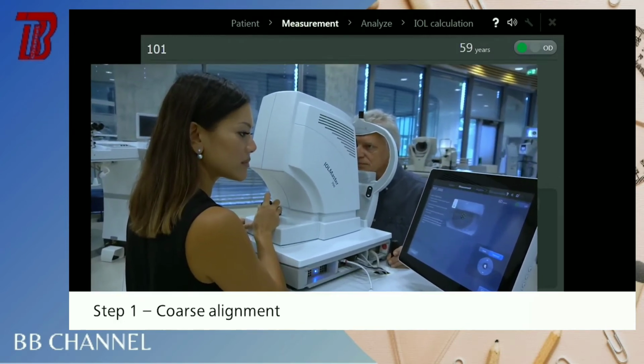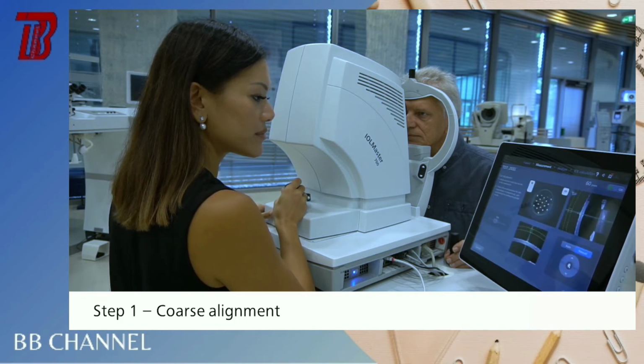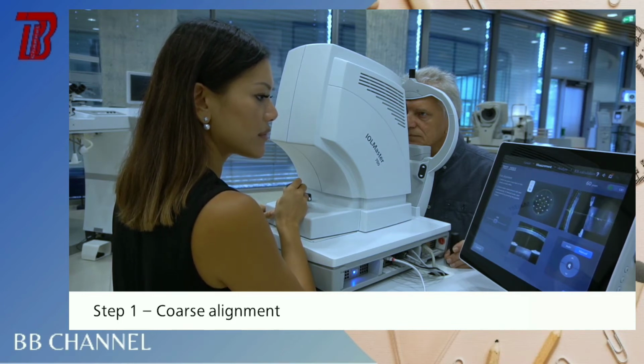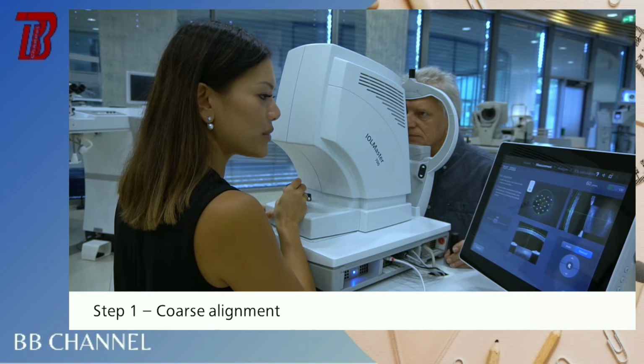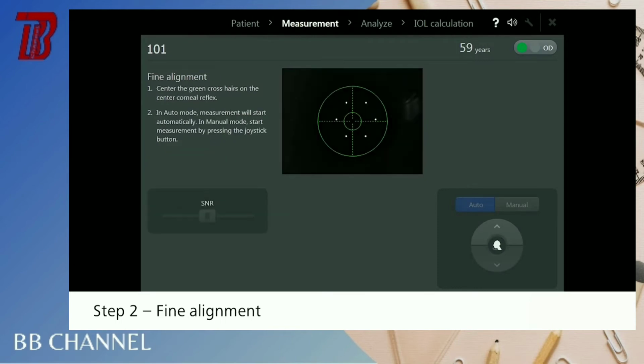Green indicates that the measurement is correctly aligned and measurement can be triggered. In auto mode, measurements will start automatically. In manual mode, start measurement by pressing the joystick button. Now move the yellow dots into the green box for correct alignment. Measurement will be triggered depending on your mode. Maintain alignment until measurement has completed.